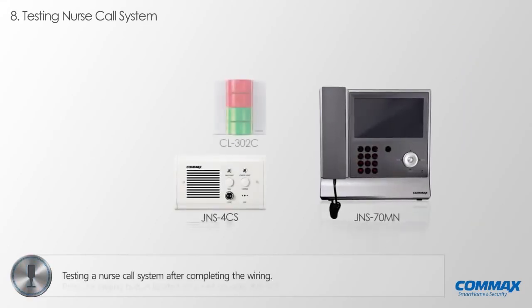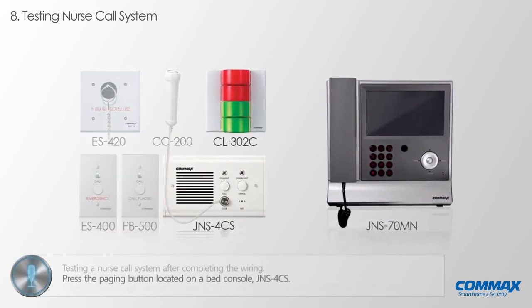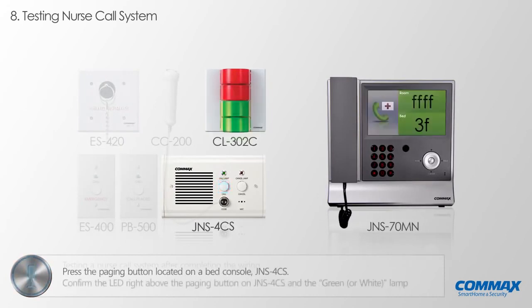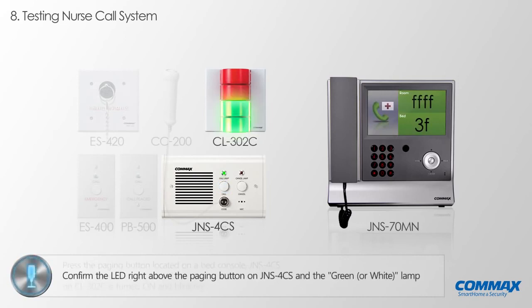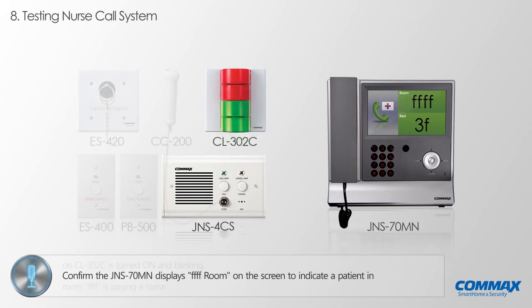We would like to demonstrate how to run an initial test after wiring is completed. First, press the paging button located on a bed console JNS4CS. Please confirm the LED above the paging button on JNS4CS is on and the green lamp on CL302C is turned on and starts blinking. Please confirm the JNS70MN displays FFFF room on the screen indicating a patient from the room FFFF is calling for a nurse.